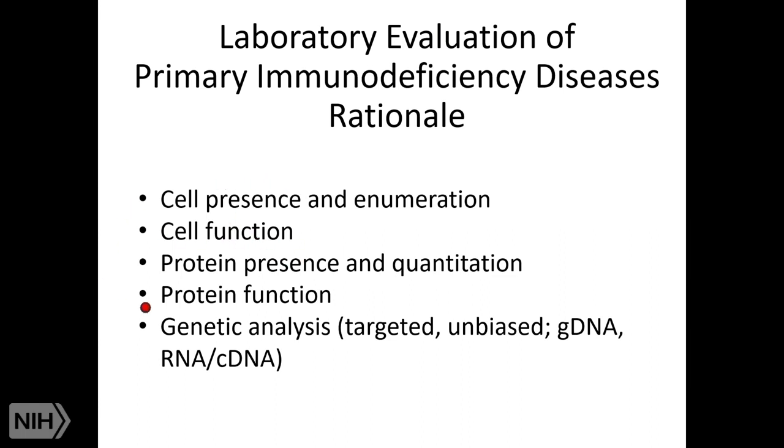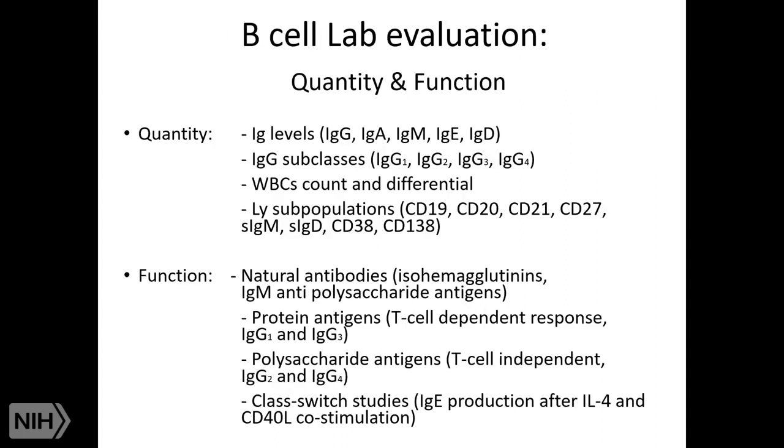The same applies to proteins. The protein has to be present and in the right quantity, the right amount of the protein, and also protein function. And then we have genetic analysis that we will not discuss today, because that was already very clearly addressed by Hal Hoffman and by Ivona Ksentikiewicz. So what I'm trying to tell you is that everything we're going to discuss here is related to quantity and function, both of proteins plus or minus cells.